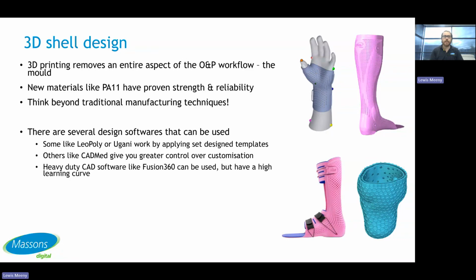General heavy-duty software like Fusion, as we mentioned earlier, they can absolutely be used for 3D shells as well, but it's a massive learning curve, especially if you're getting into CAD the first time. If you're a well-experienced user, fantastic.